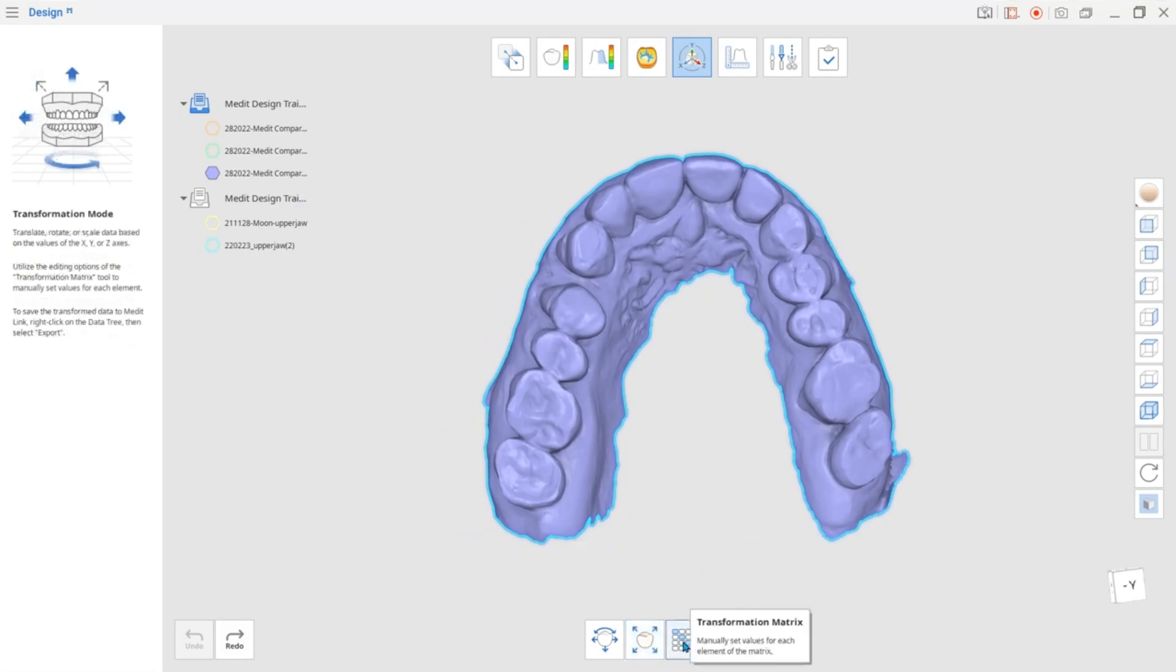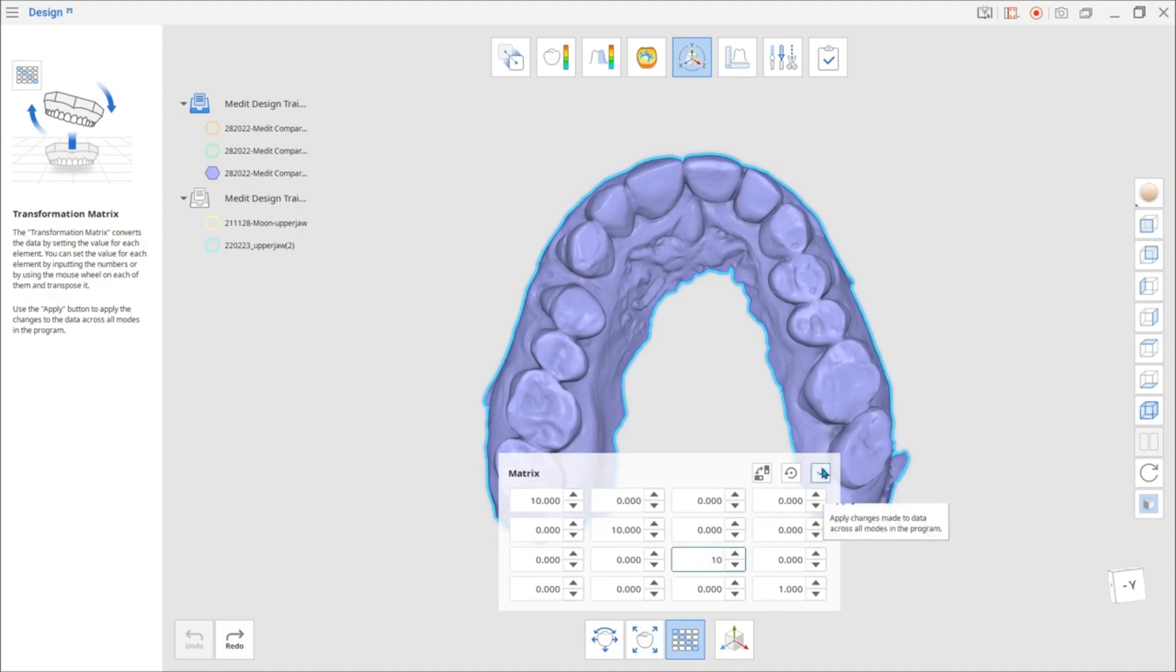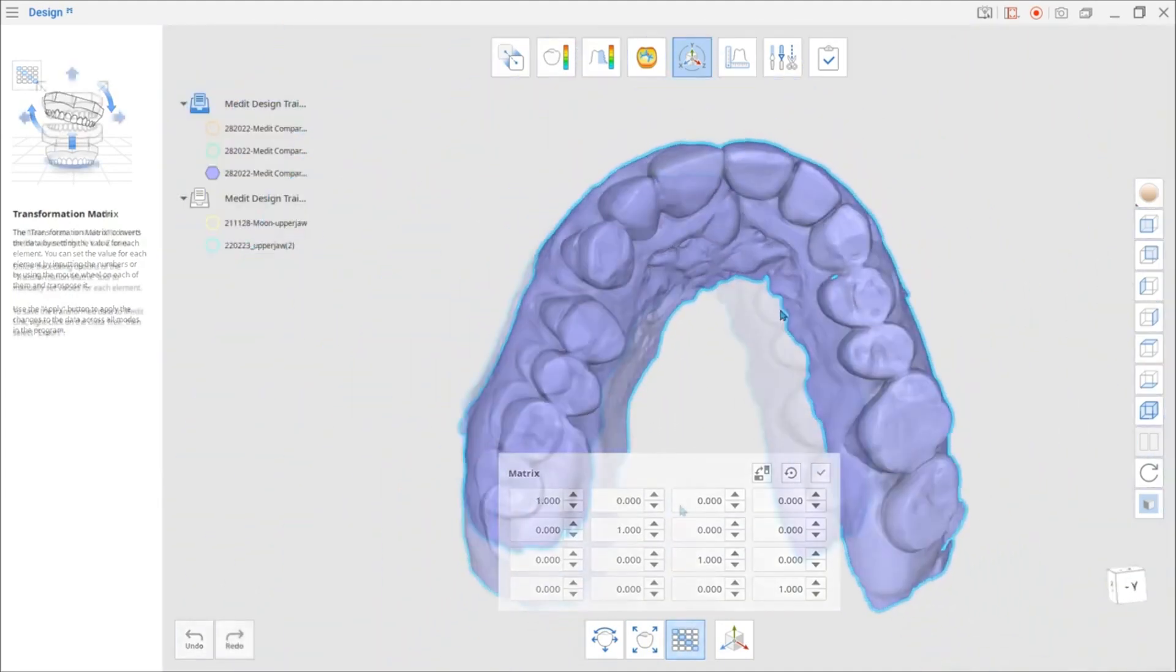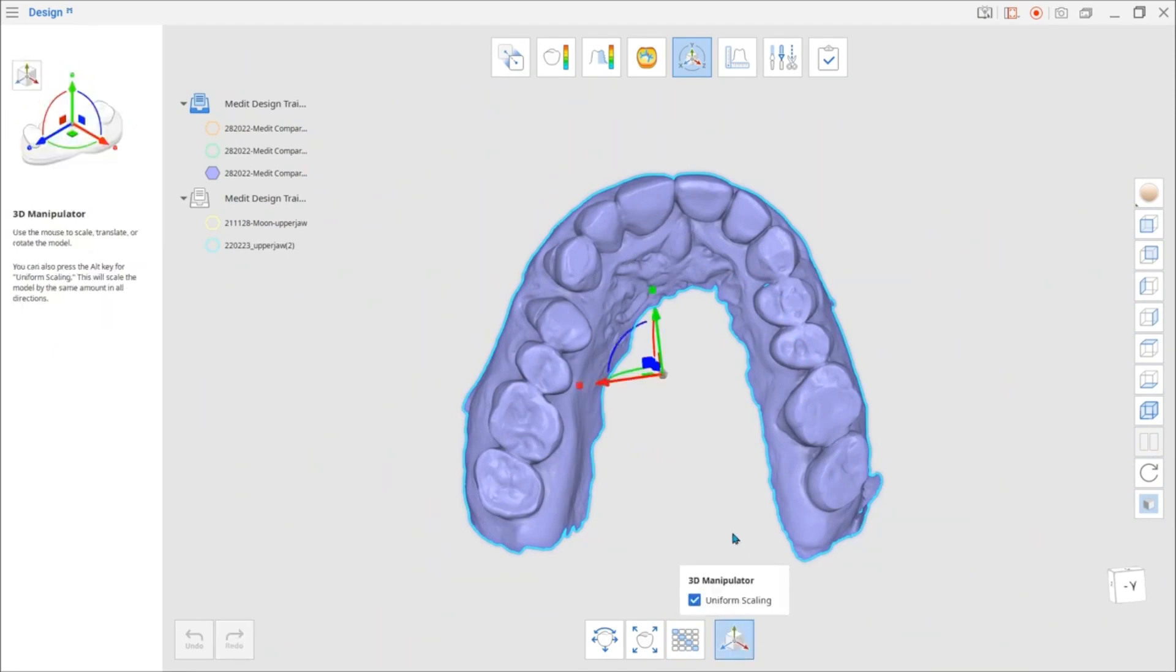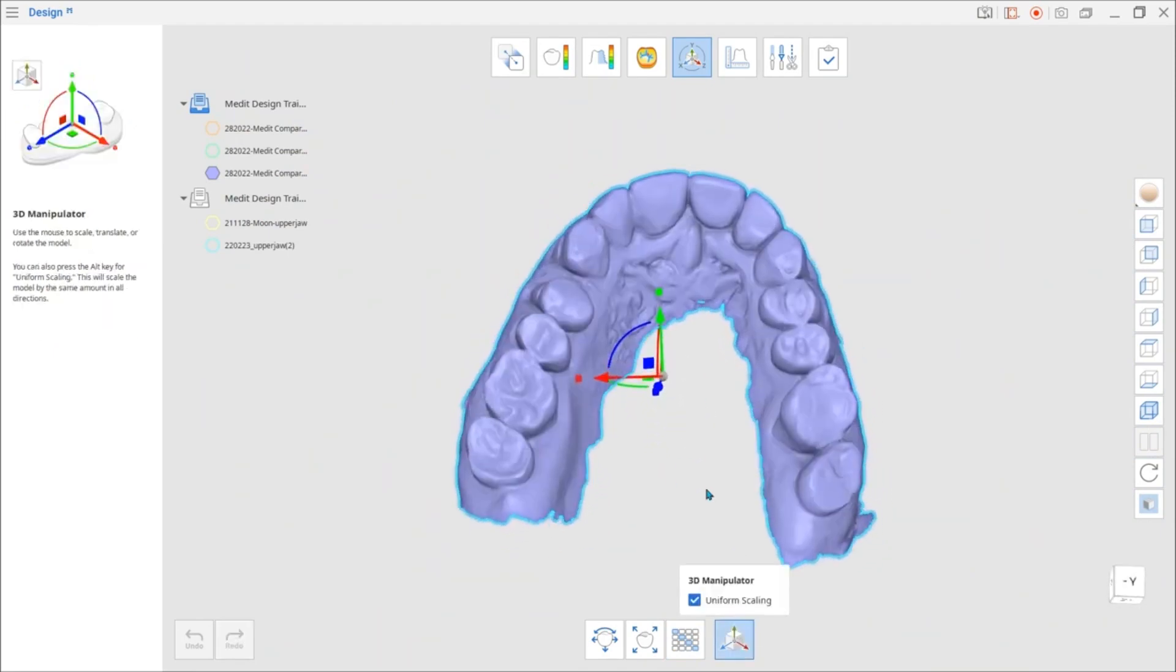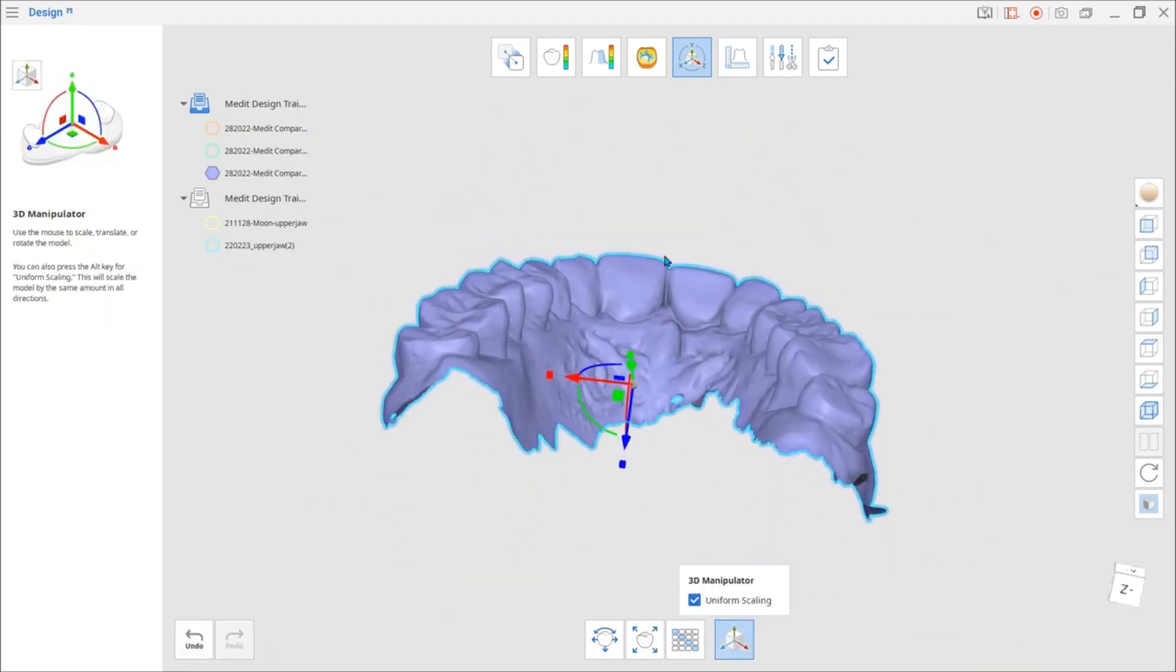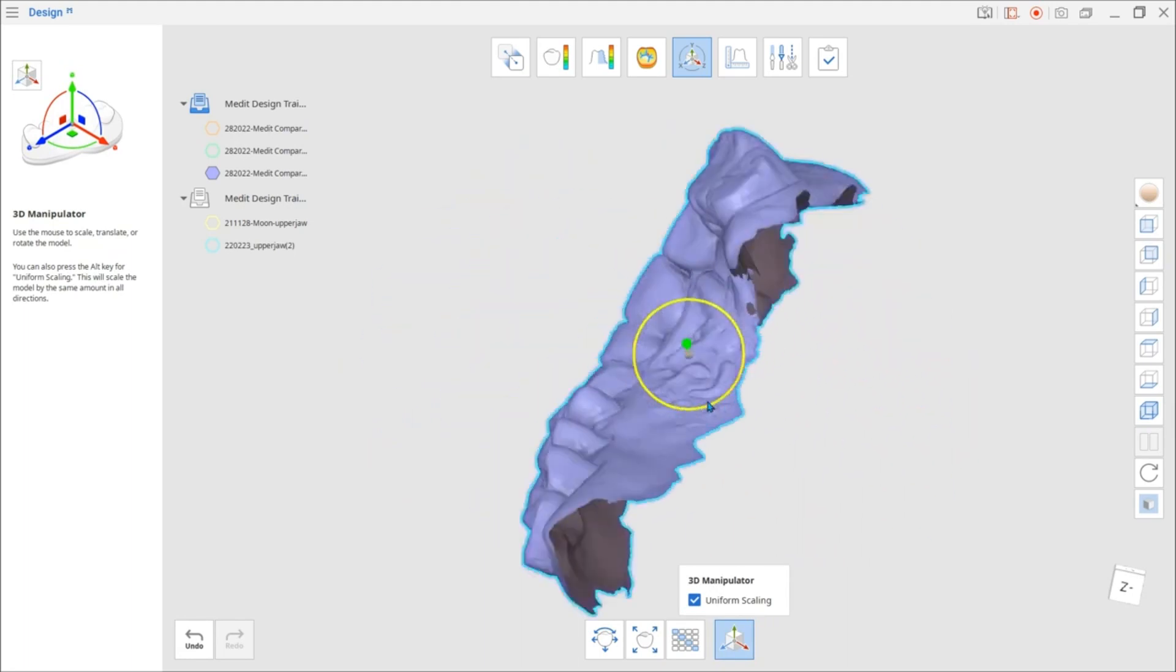The next tool is the Transformation Matrix. Use it to convert the data by manually setting values for each individual element. 3D Manipulator allows easy scale, translation, and rotation of the model by utilizing the Manipulator with your mouse.